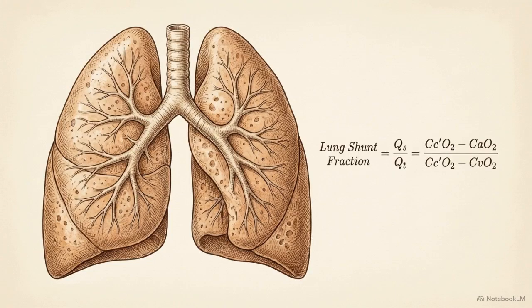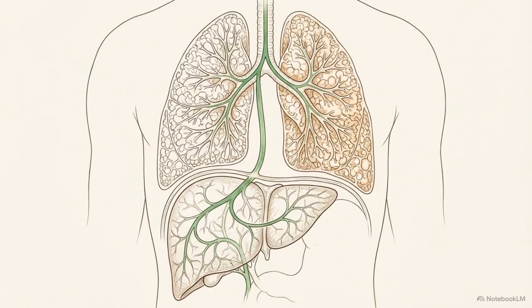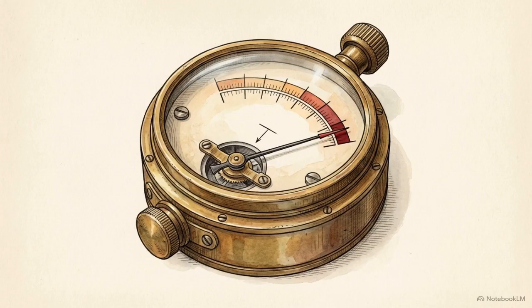Because these beads emit high-energy radiation, preventing uncontrolled movement through the bloodstream is critical. Physicians must first calculate the lung shunt fraction. During a pre-procedure mapping run, a tracer is injected to determine exactly how much fluid naturally bypasses the liver's capillary beds and escapes directly into the pulmonary system. This establishes a hard safety limit. If the calculated shunt fraction would deliver greater than 30 Gray to the lungs, Y90 therapy is strictly contraindicated. Gray is the standard international unit used to measure absorbed doses of ionizing radiation.